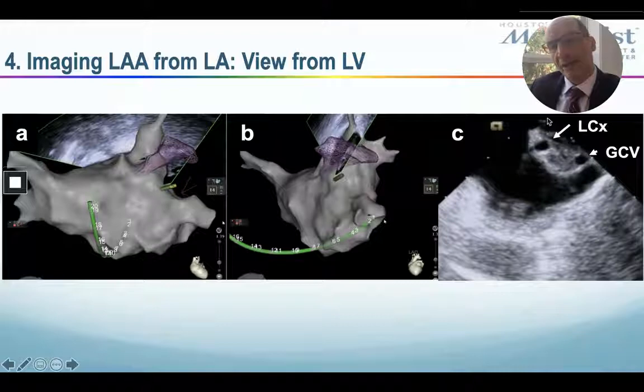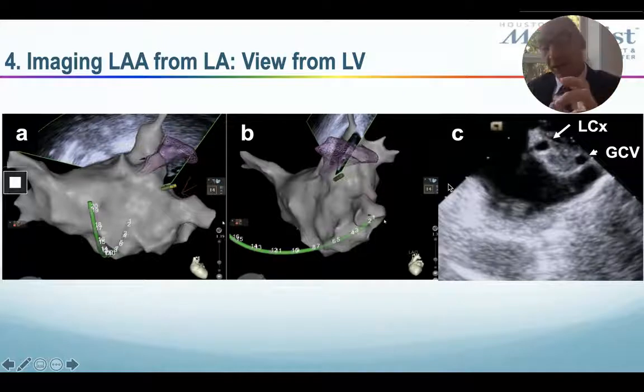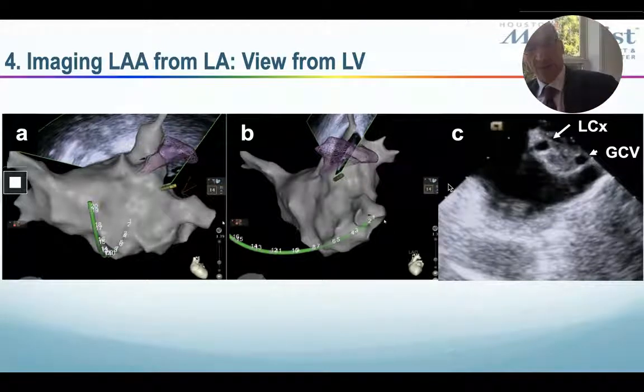The transducer is just past the mitral valve, where you can see the mitral annulus here, and on the epicardial aspect, you see the circumflex and the great cardiac vein, and on top of those, you see the left atrial appendage. It's sometimes hard to get the transducer to go across the mitral valve, but once you do that, it's actually a beautiful view.